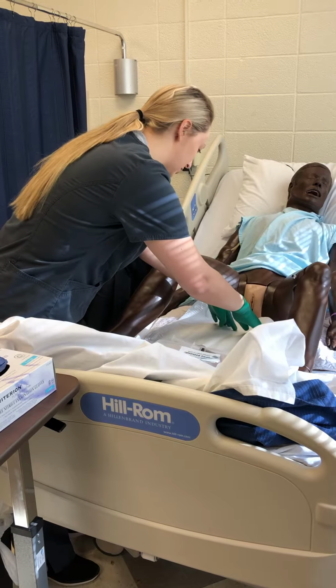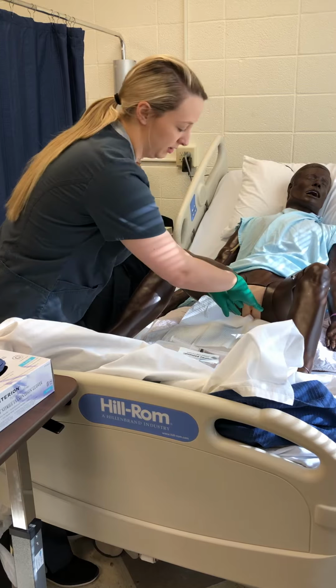Placing a drape under your butt. You can lift it for me. I would place it a little bit under the bottom.